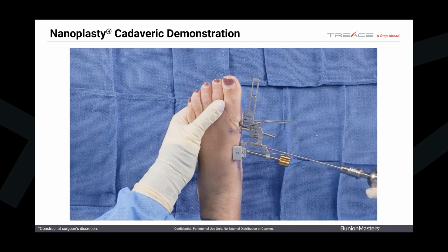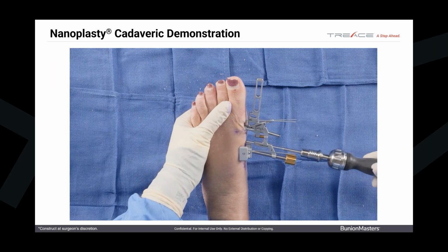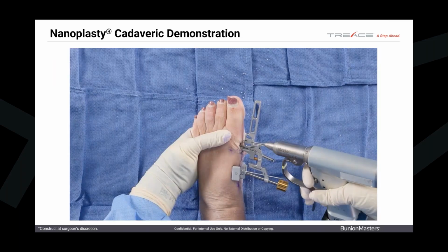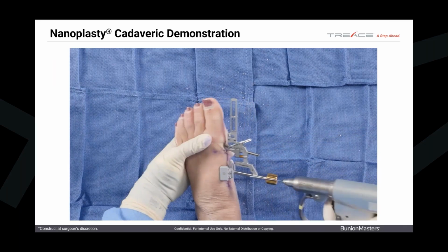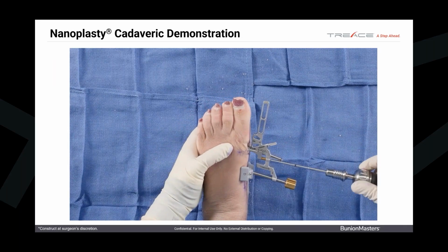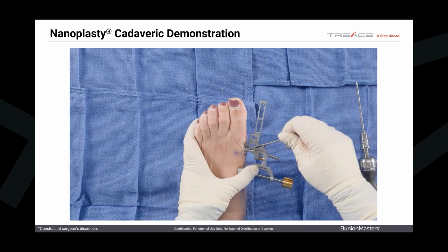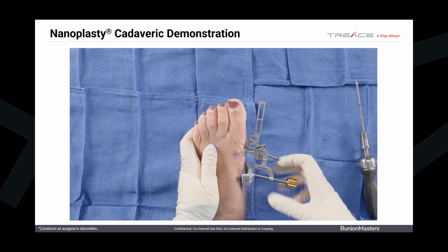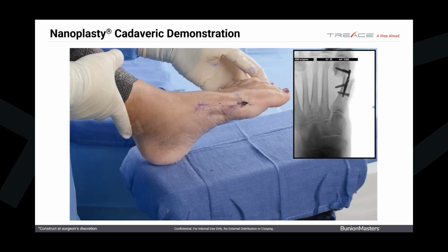And then we provide you with 3 lengths in your set in order to insert the appropriate screw that you have. So once you get that screw in place and it goes down to the cortex, you're fully fixated. You can take all your wires out. You can unwind your correction of your translation, back off your connection rod, and back off your control rod, your control knob, and then your jig will come right off the plate. And there's your correction through a 1.5 centimeter incision.